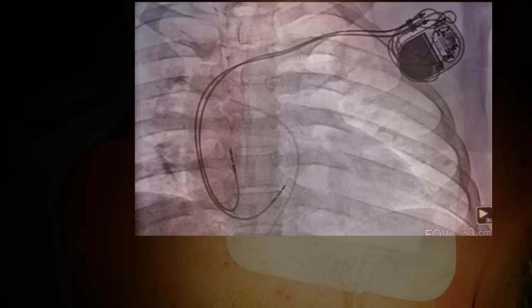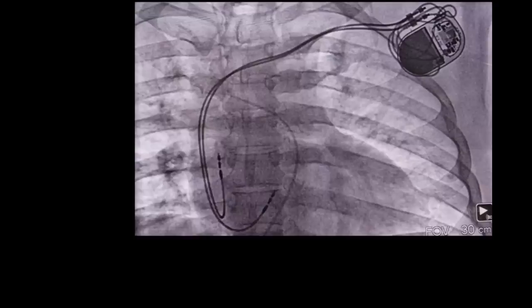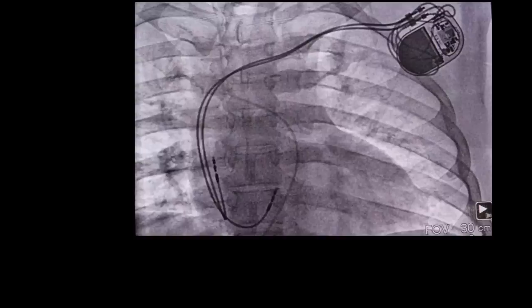There's the final position of our lead system moving beautifully with the motion of the heart, top and bottom chambers, His bundle pacing. The pacemaker is sitting over the lateral rib margin and will be comfortable for the patient — he will not even know that it is there.